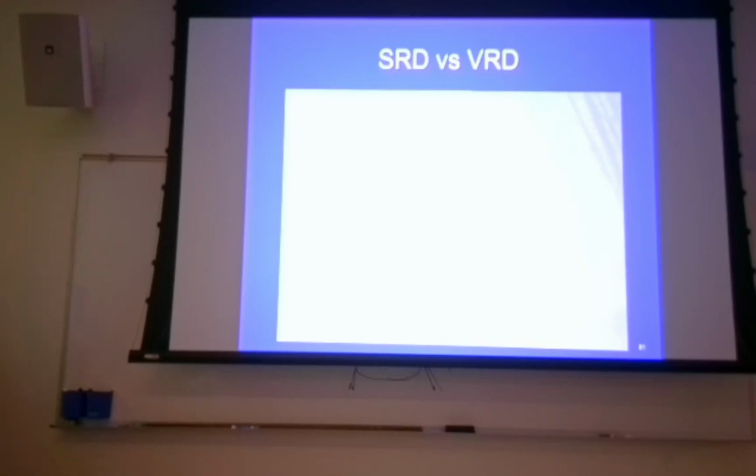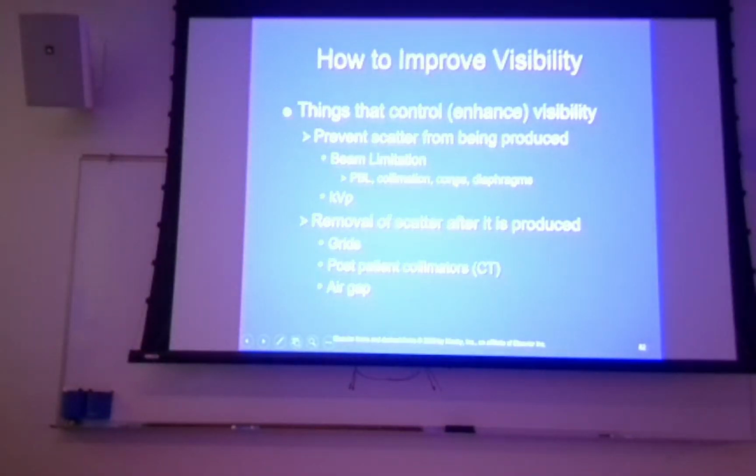So the dynamic range, the contrast resolution, is what we're looking at for CR and DR over film. The image was always there. It's just that we couldn't pick it out all that well. So that's how it is that CR and DR has improved our image.